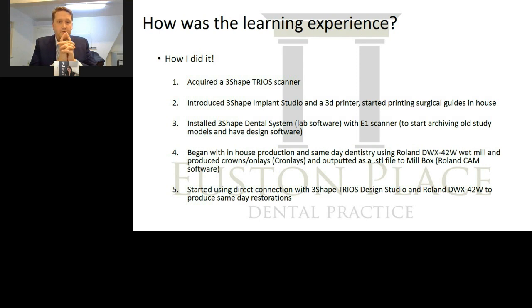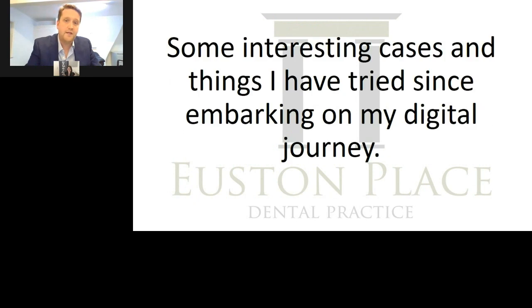We're doing crowns and onlays, and initially we were outputting it via an STL file into Millbox, which is the Roland CAM software. And then once we moved from Dental Systems onto the Trios Design Studio, we got that trusted connection with the Roland DWX-42W and started producing the same day restoration straight out of Design Studio, which is a much more efficient workflow.